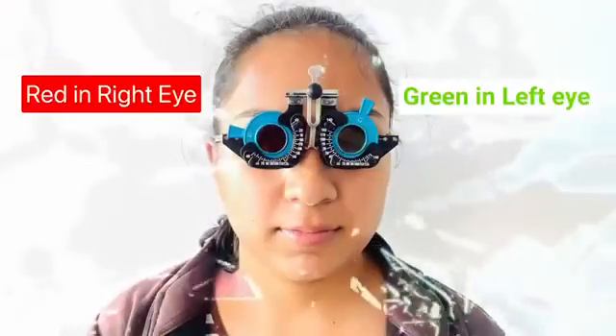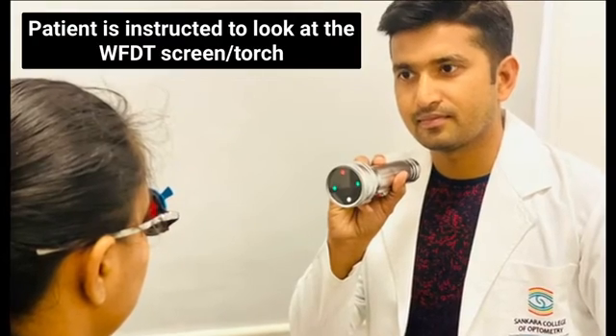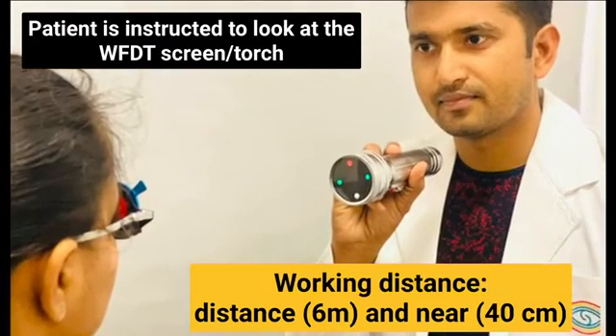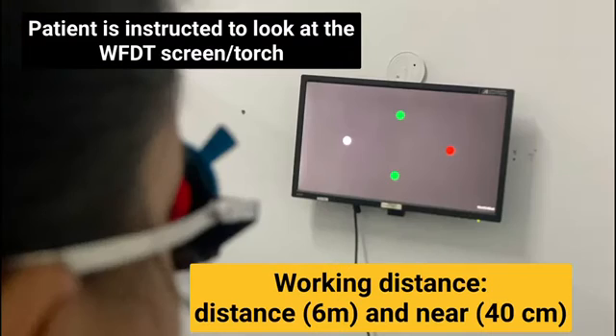Ensure that the patient is fully corrected for refractive error. This test is performed in a dim room illumination. Ideally, the red filter should be placed in front of the right eye and the green filter should be placed in front of the left eye. Ask your patient to look at the Worth 4-Dot torch or screen. This test should be performed for both near and distance.